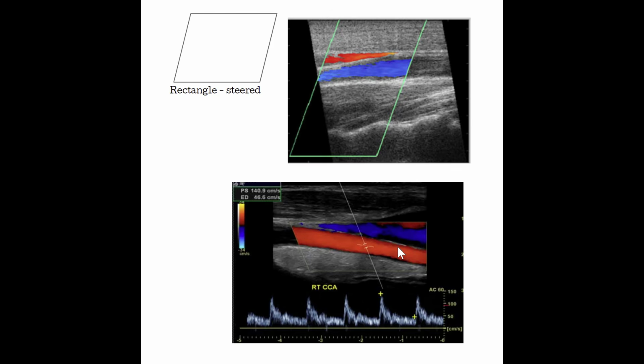So with linear sequential array transducers, remember that B mode is typically achieved through sequencing unsteered small groups of crystals. If we steer at any point, we need to introduce phasing, and that is achieved electronically through the patterns of voltages applied to the crystals. The second part that I want you to remember is that phased transducers activate all of the elements. When we introduce phasing into our linear transducers, we're still only phasing small groups of elements. We are not phasing all of the crystals at this point, just those small portions.